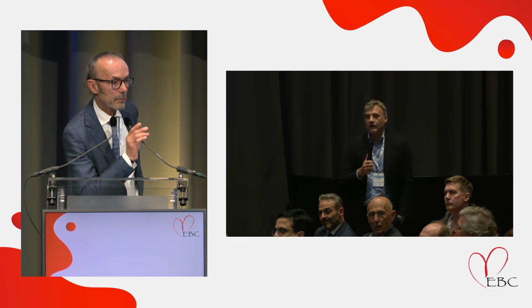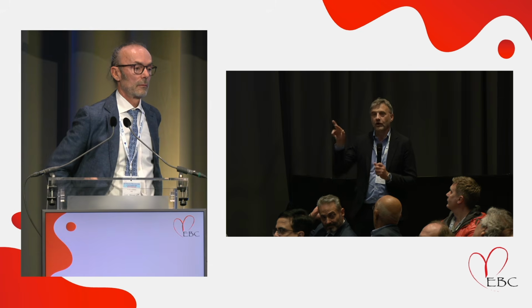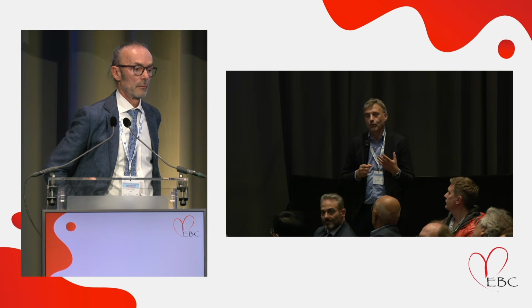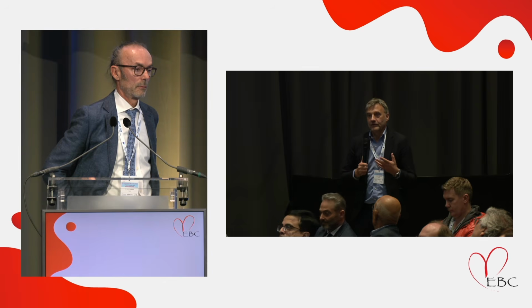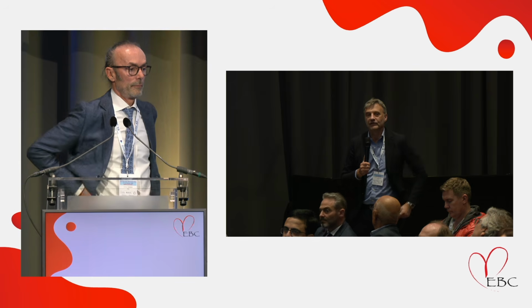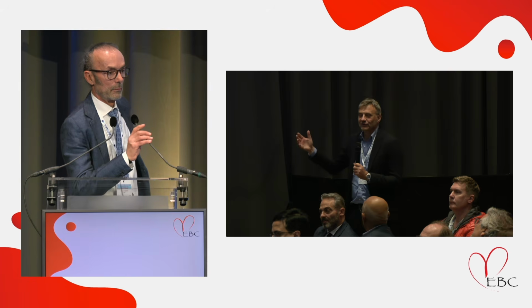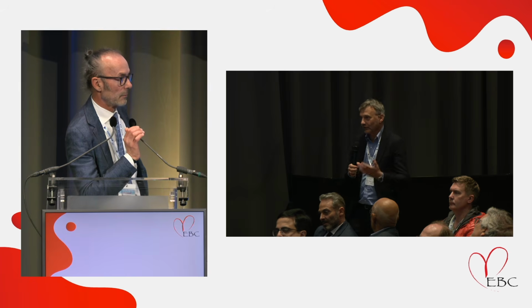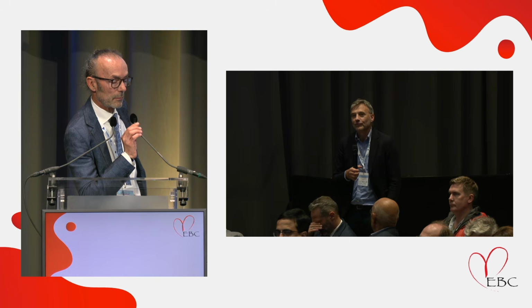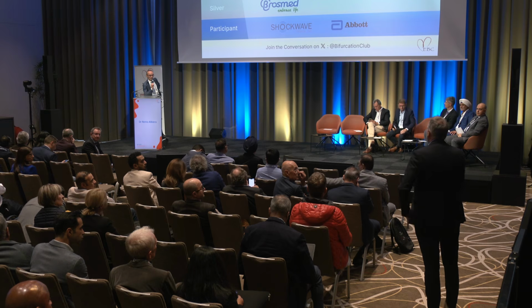Right. I've had a bunch of 001 lesions where on the stent boost I was really not happy with how well I dilated the ostial circ, where I felt I had some recoil. And then what happens is you increase your aggressiveness to dilate that, and one day it doesn't work. Then you get a perforation there, and now I'm back to not being so aggressive.